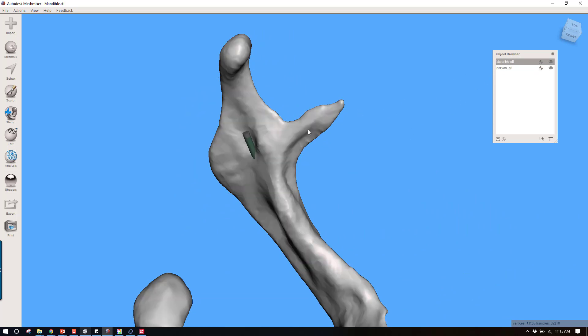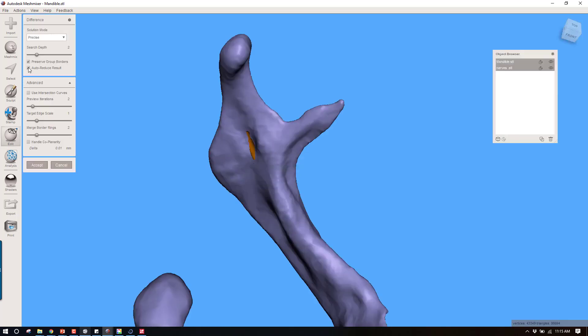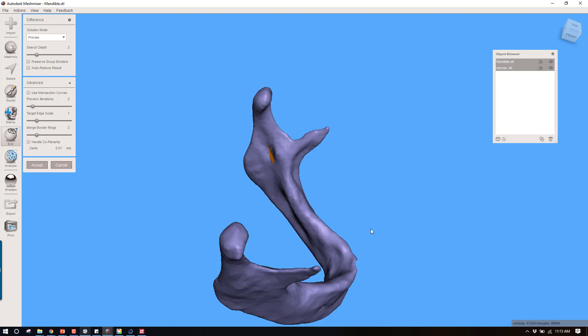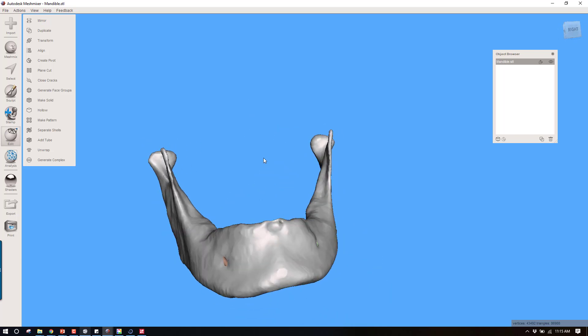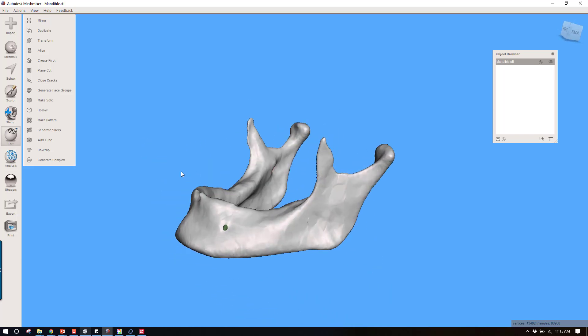We're going to select the mandible, control, select the nerve, boolean difference. Uncheck preserve group borders, uncheck auto reduce result. And here we have it. Now we have this really nice model.